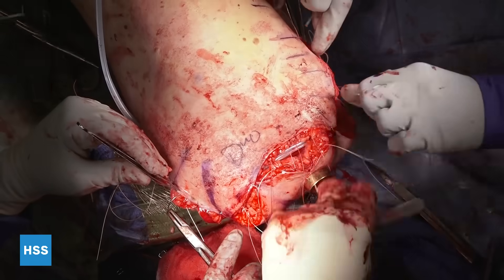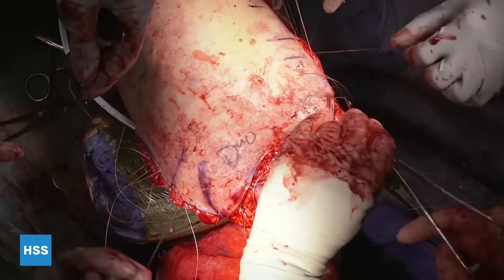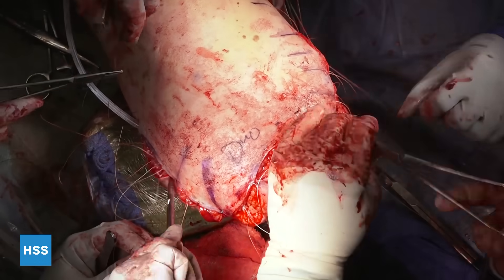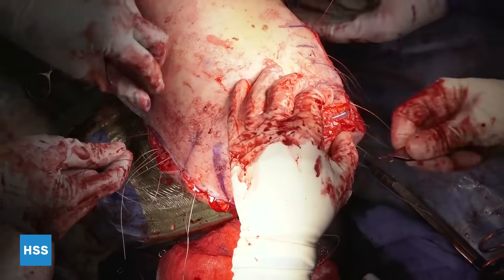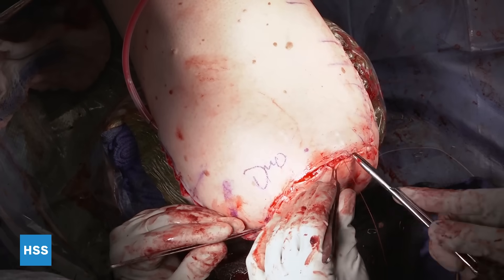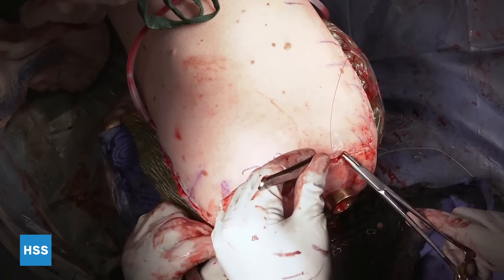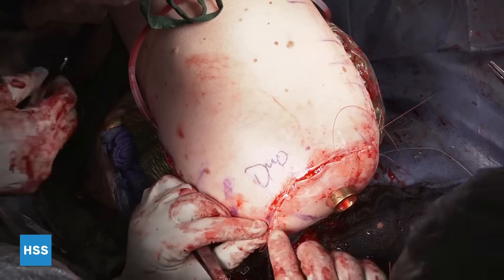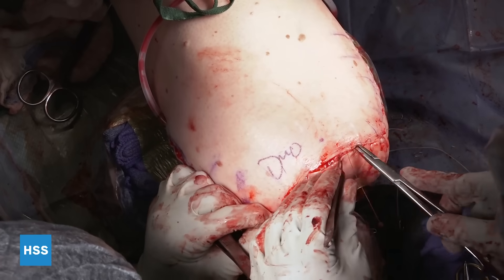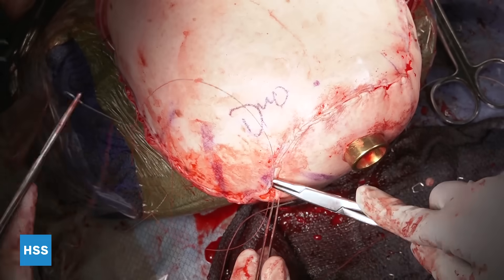A zero Vicryl layer and then a subcuticular Monocryl layer are used. Closure is performed over a drain. The staples were just put in temporarily to help with planning of the closure.